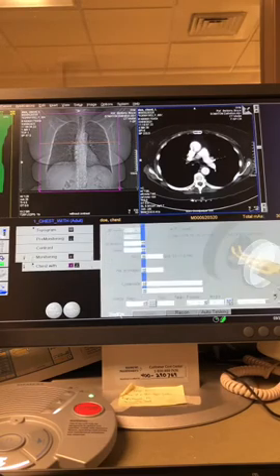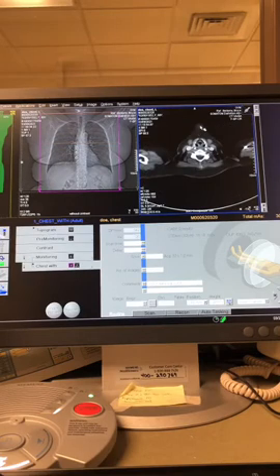Then we look at the chest. The chest is going to count down another 10 seconds. So for this scan, it began 23 seconds after injection. Right now, typically a chest, if you weren't going to bolus track, you could scan the chest at 25 to 35 seconds and be okay. Bolus tracking is amazing because it specializes.